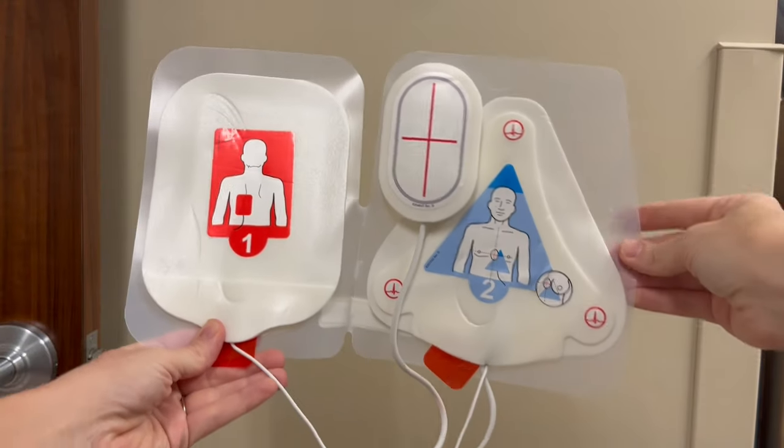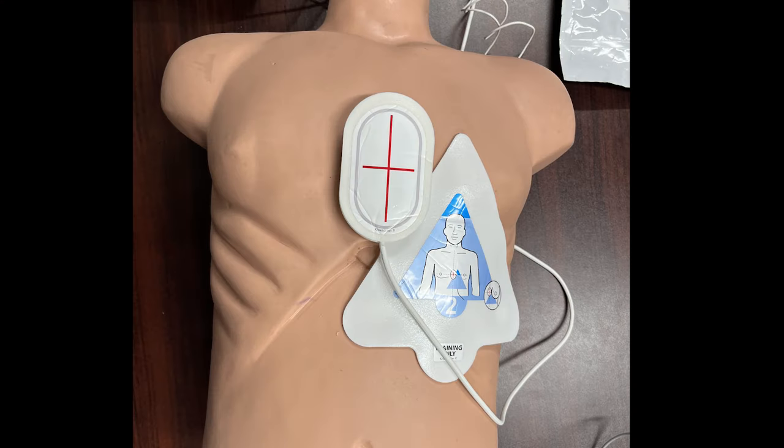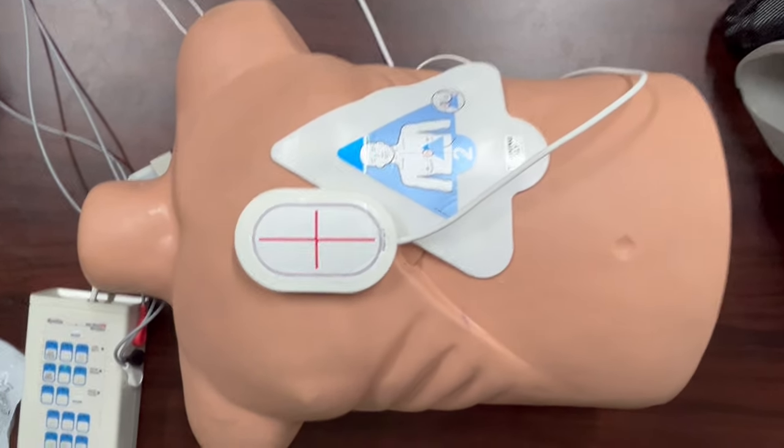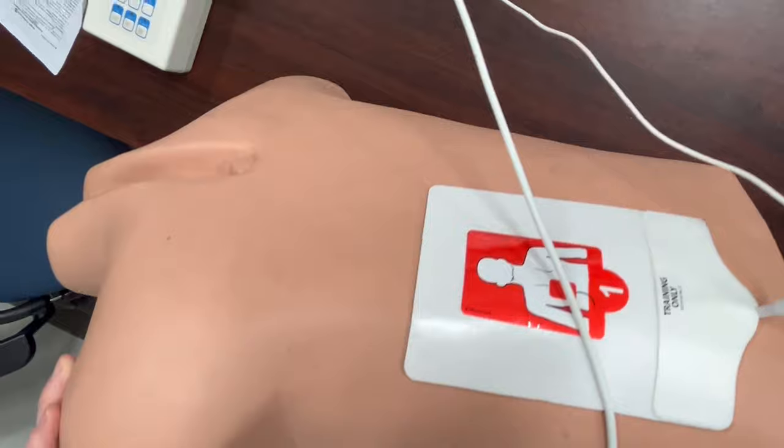When placing the pads, open the package — these are the pads you will see. Place the cross approximately at the nipple line or the mid sternum; this cross is where you will perform CPR. In the front you only need this pad, then you will place the other pad on the back below the left scapula.